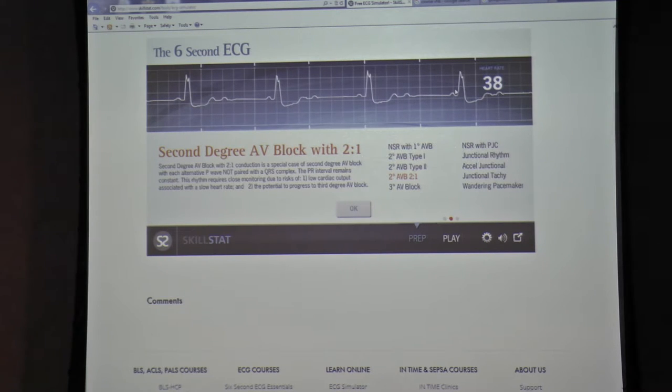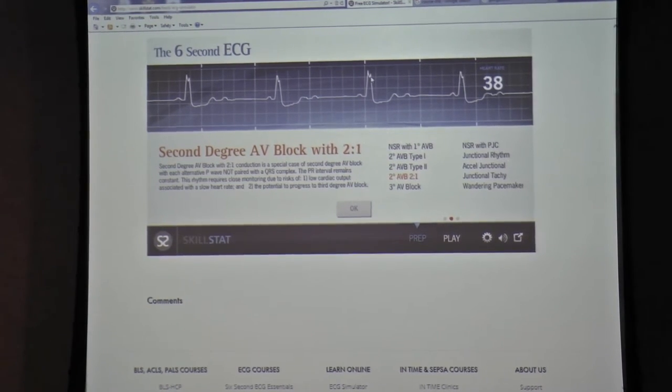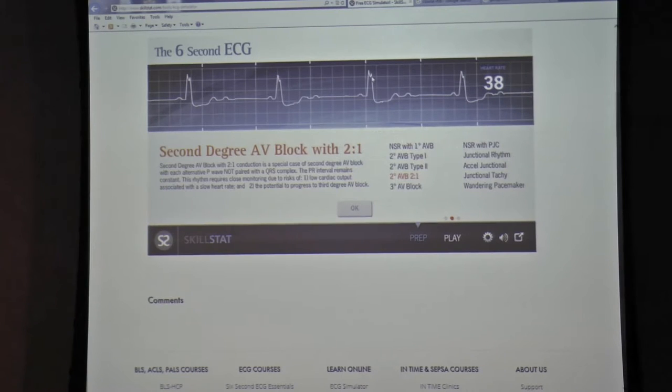But that's just sometimes. I don't want to introduce the term, but it could be something called a bundle branch block. Okay, so remember, when it goes down into the ventricles, you have your bundle of His and then it splits into the two bundle branches. So you could have a situation where one of the bundle branches gets blocked. That bundle branch gets a different shape. It's not 100%. A notched QRS doesn't always mean a bundle branch block, but it could be.